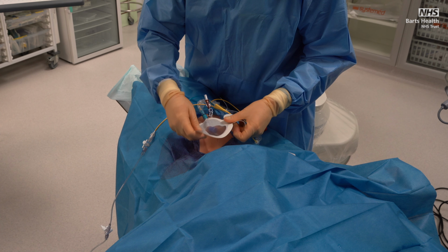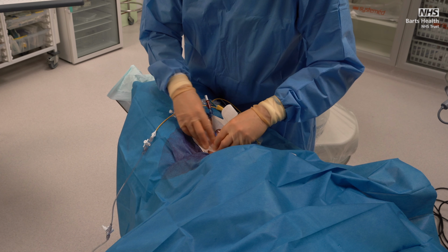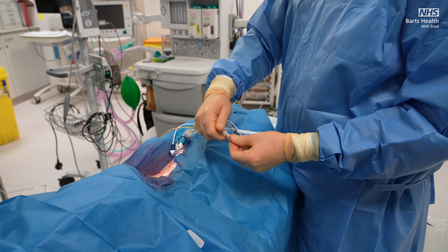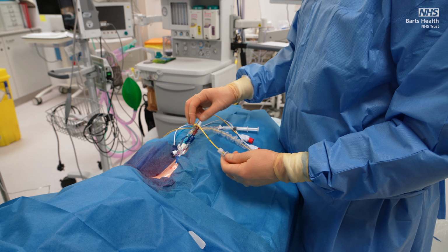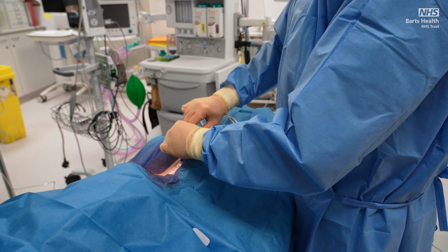Secure the catheter and apply an adhesive dressing. Next, lock the catheter in position by using the torque mechanism at both the end of the sheath and on the proximal end of the introducer.